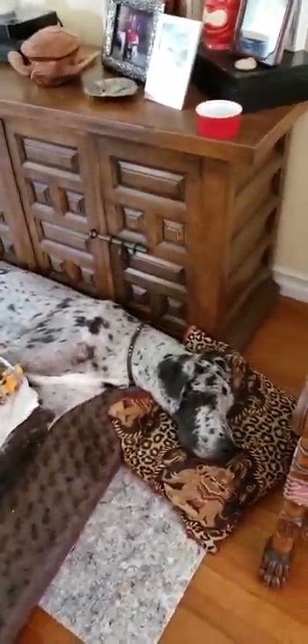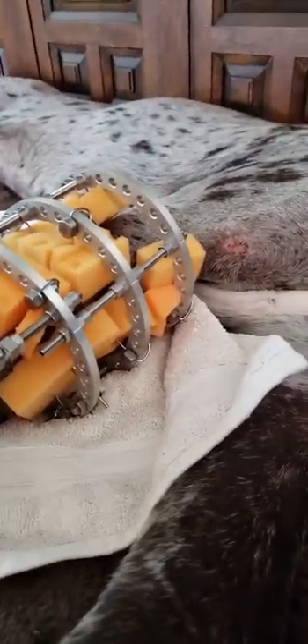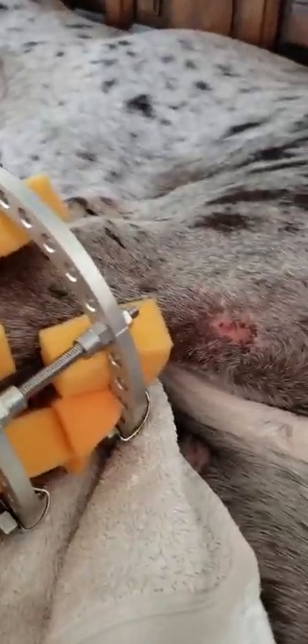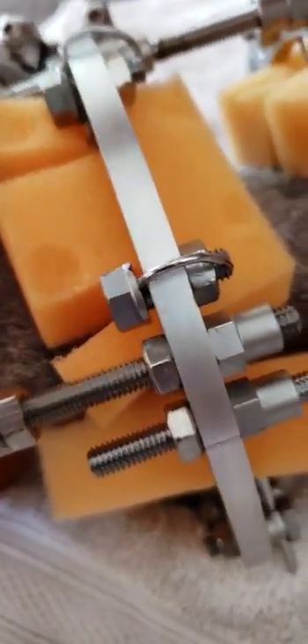Here's Ricky — we just finished another dressing, it's our second time and it's a pain. What we have to do is clean off each of the pin sites with a gauze impregnated with chlorhexidine. Then we cut them up and buff them like dental floss around the base at the skin to get off all the crusty blood or pus, and then after that you put a sponge on it.